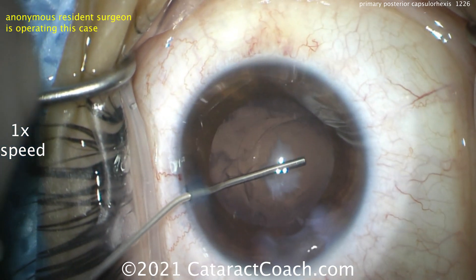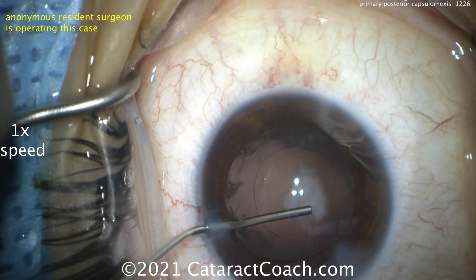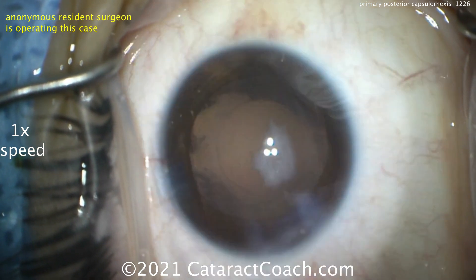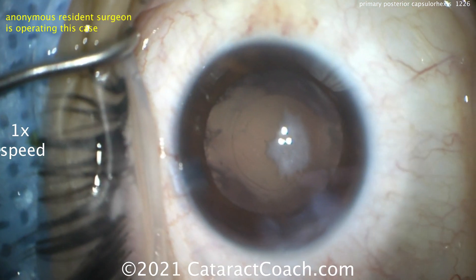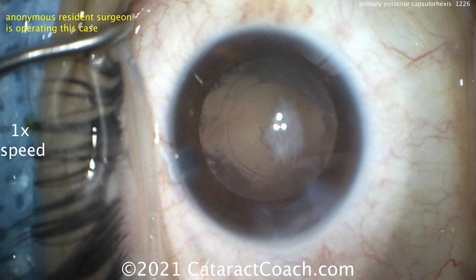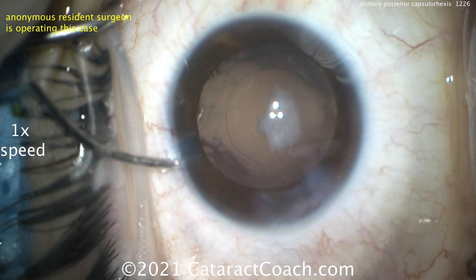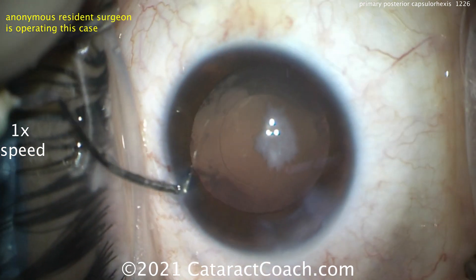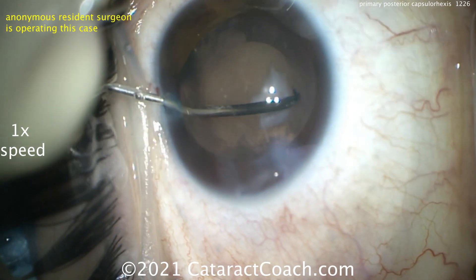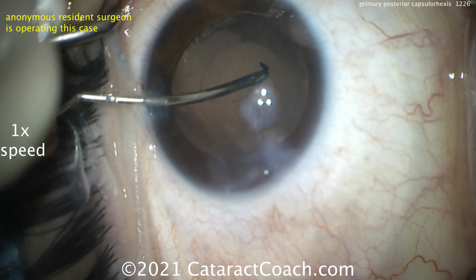Let's go to normal speed now. Filling the eye with our cohesive viscoelastic — you can expand the capsular bag and see the plaque area. What we're going to do is make a primary posterior capsulotomy, or capsulorexis. The first thing is to open the capsular bag using the cystotome again. Once we open it, we want to put a small bolus of viscoelastic to create a barrier and push back the anterior hyaloid face. We can go in through the paracentesis or the main incision — just be sure to pivot so you don't deflate it. Let's get a capsulorexis started and poke into that capsule.